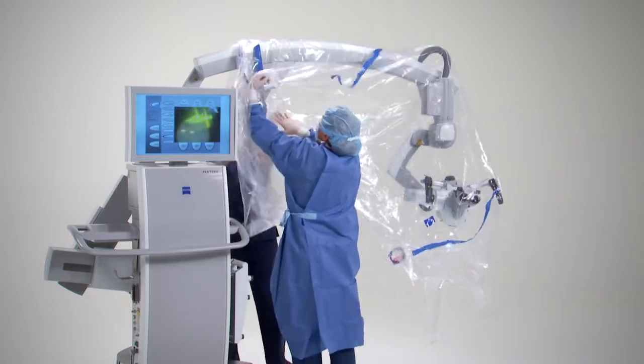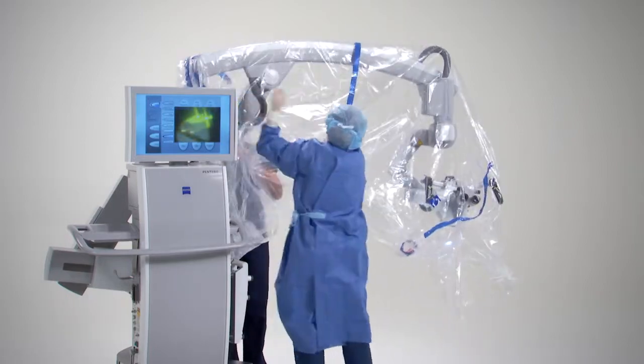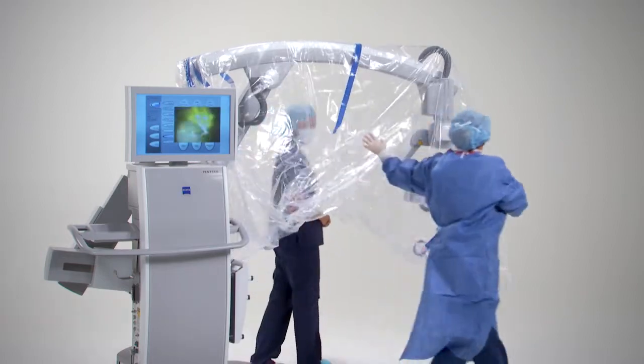Make sure that there is slack in the drape to allow for swivel, tilt, and rotation of the microscope, especially around the handgrips.